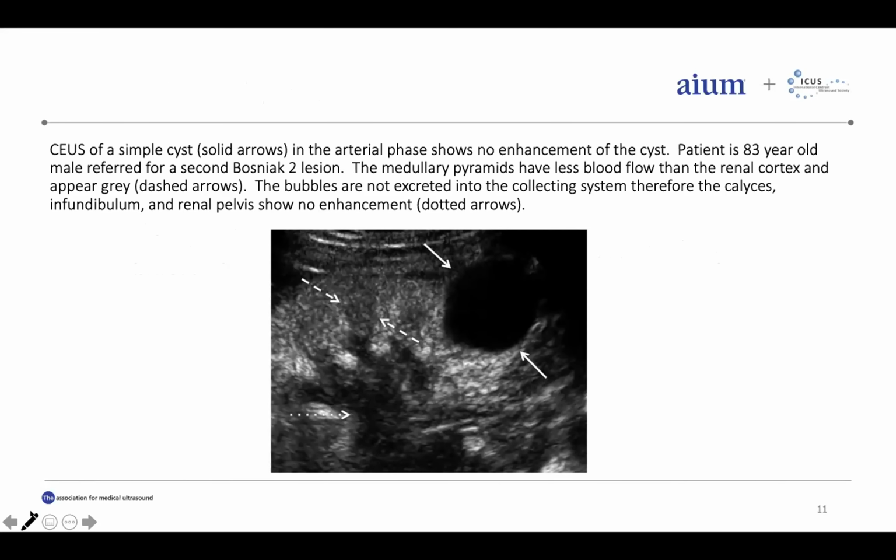So if you can see here, let me grab an arrow. This is actually a 20-plus-year-old image, and I show you this because this is really a robust procedure. When we had equipment that was 20 years old, we still got excellent results.